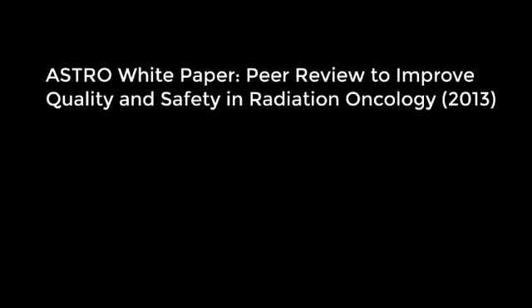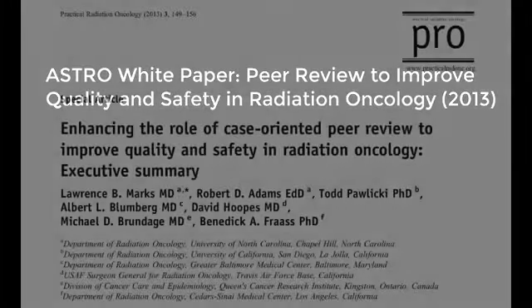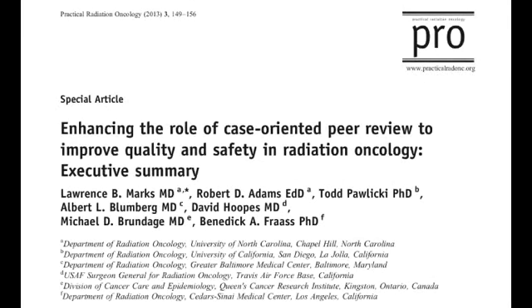So peer review. One key reference is this Astro Safety White Paper on peer review, published in 2013. This is led by Dr. Larry Marks and physician and physics colleagues from Astro. And I won't go through all the details in this paper and these recommendations, but here are some key things here. So they talk about the need to review target definition.